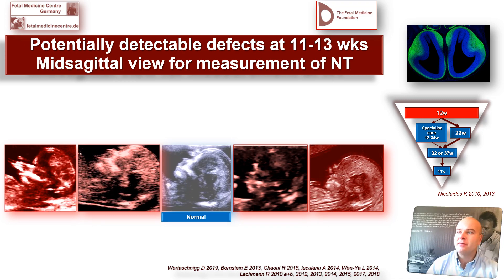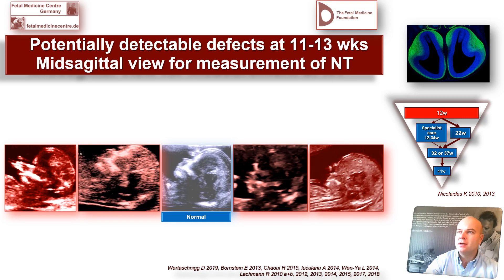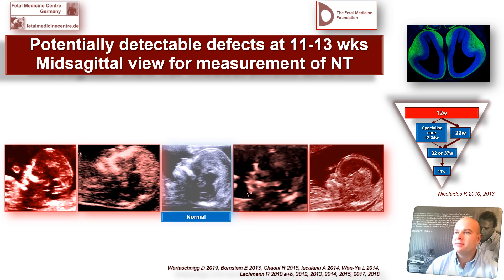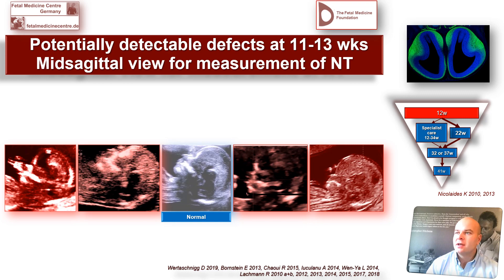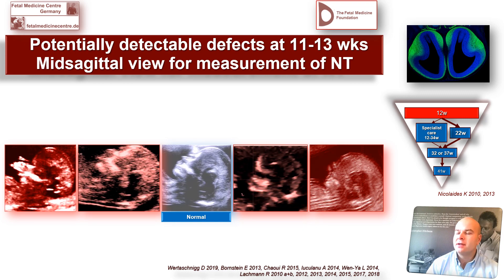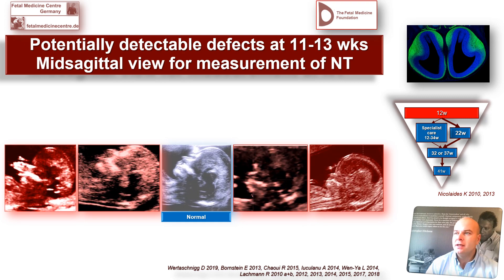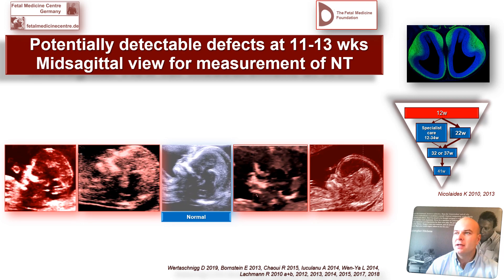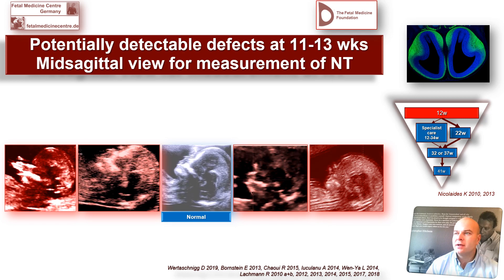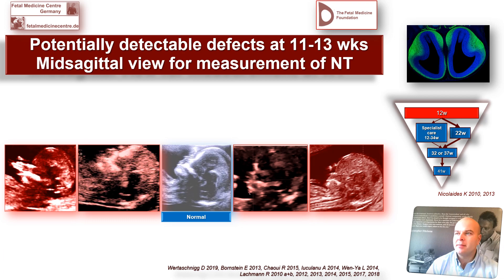First, I want to show you the normal fetus. If you look at the sphenoid bone, which is clearly visible in this middle picture, there behind that, in the distance to the occipital bone, there are two lines. The one closer to the sphenoid bone is the border between brainstem and fourth ventricle. The next line, a little bit closer to the occipital bone, is the fourth ventricle to cisterna magna border.